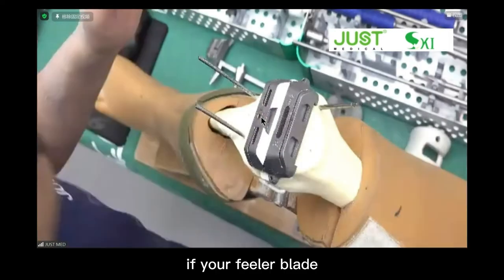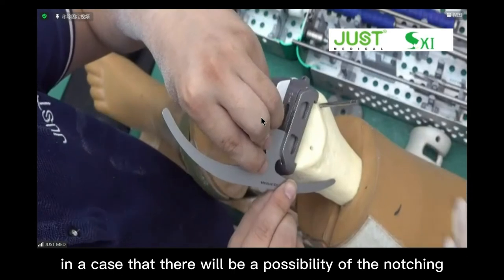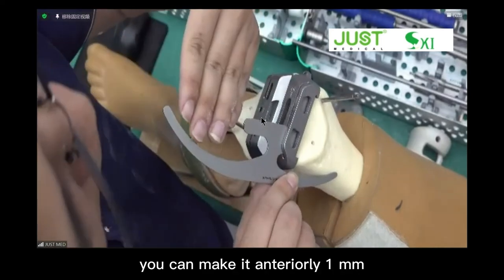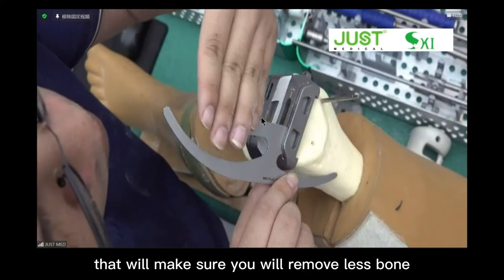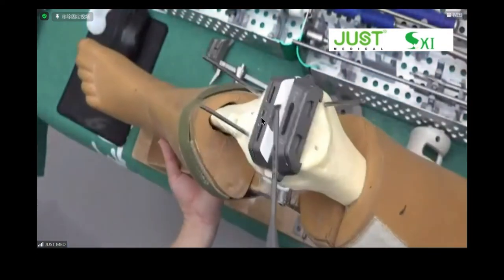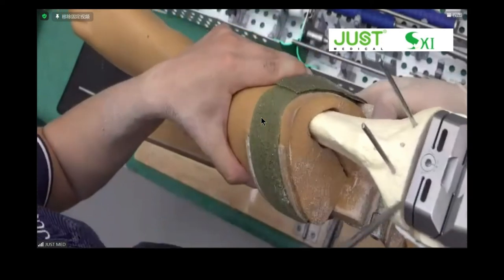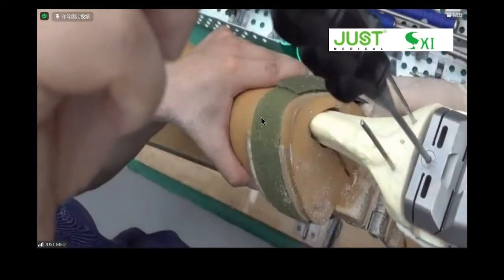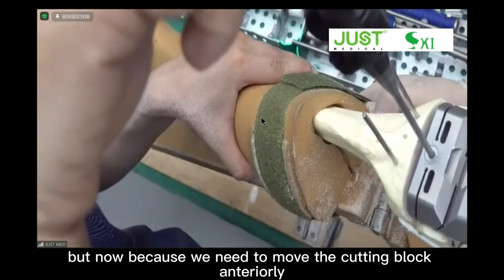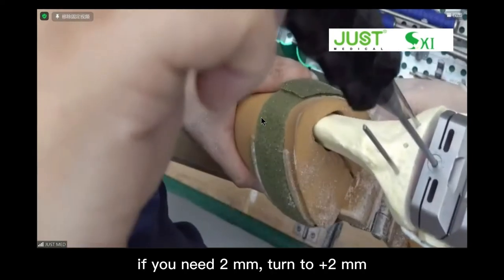For example, if your feeler blade indicates that there is a possibility of notching, then you have to adjust the cutting block. How to adjust it? You can move it anteriorly 1 millimeter. That will make sure you remove less bone to avoid a notch. How to do that? Like I said at the start, I reminded you to set it at zero. But now, because we need to move the cutting block anteriorly 1 millimeter, we turn to plus 1. If you need 2, you turn to plus 2.